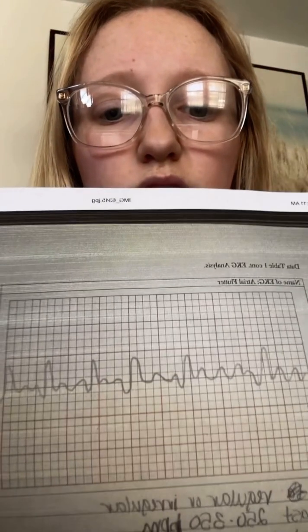Next we have, this one is atrial flutter. You can see it. This one is regular or irregular, and it's fast, 250 to 350 beats per minute. The atria contract rapidly, causing inadequate blood supply to the ventricles.